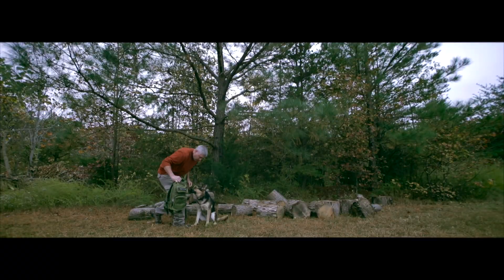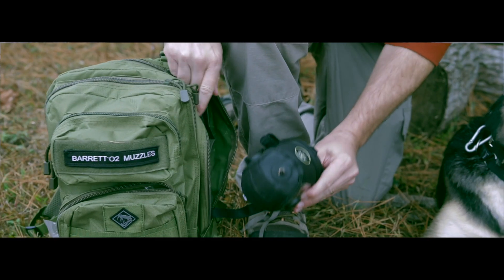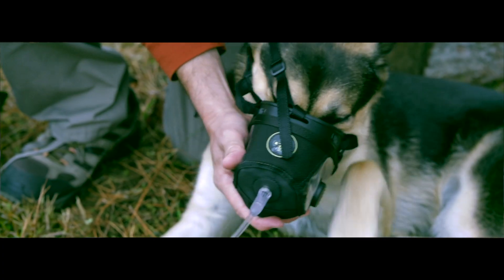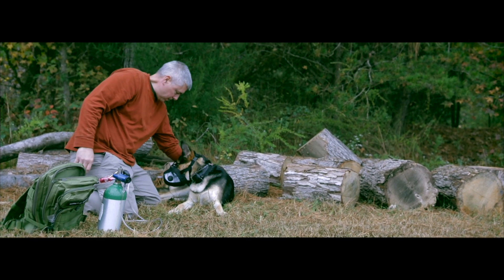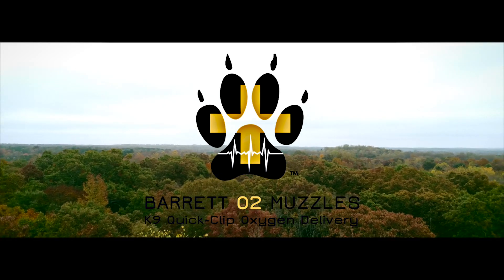Having been made of tactical mesh coated in a water repellent finish, durable clips to hold it firmly in place, fiber nylon adjustable straps, and a resilient oxygen connector, this muzzle was built to withstand strenuous environments. The Barrett O2 muzzle was created for the operating canine. Barrett O2 muzzles, veteran owned and made in America.